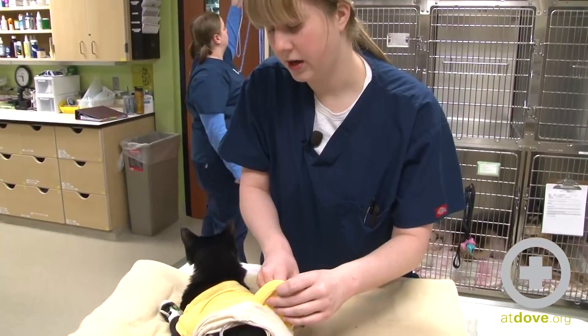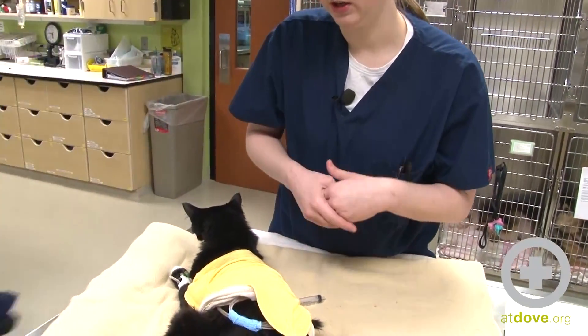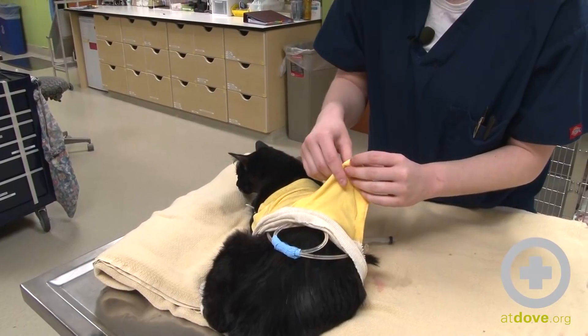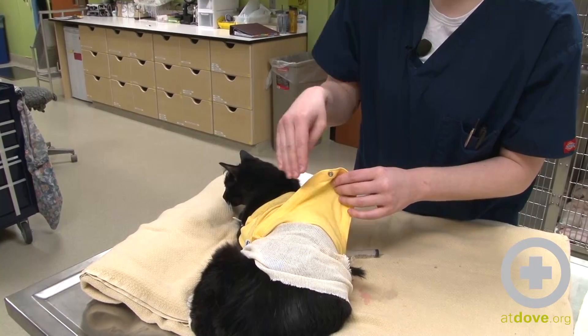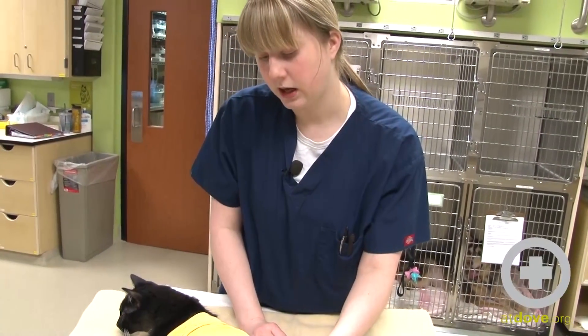Depending on what kind of tube and what size it is, there are many different options for keeping the tube from being dragged on the ground or getting the patient entangled in it. We have a pretty long tube, so we've used some vet wrap to encircle it. We have a stockinette cover to keep the site covered and the tube held up under that, and then a little onesie on to secure it a little bit more over that, which has been working and she seems very comfortable like that.